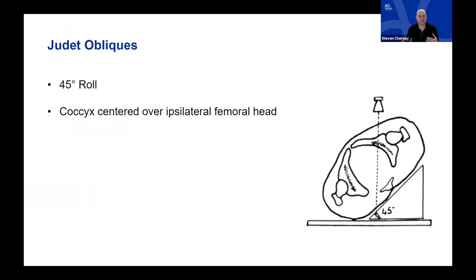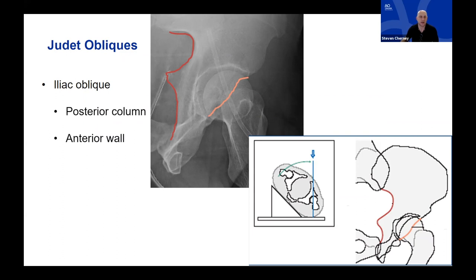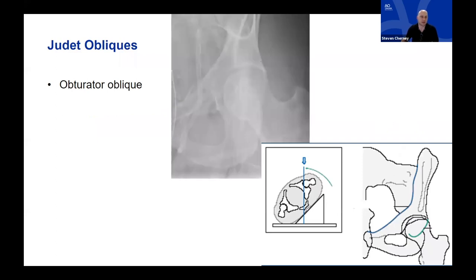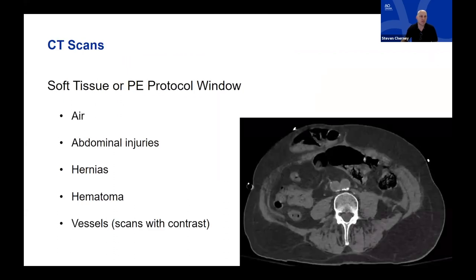For the Judet obliques, it's a 45-degree roll — you're not bending the beam, you're actually moving the patient. To judge the appropriateness of the films, you want the coccyx centered over the ipsilateral femoral head. On the iliac oblique, the greater sciatic notch down to the ischial spine denotes the posterior column in red, and the anterior wall or anterior rim is outlined in peach. The opposite is true for the obturator oblique, which is good for looking at the anterior column along the pelvic brim, and the posterior wall is outlined in green.